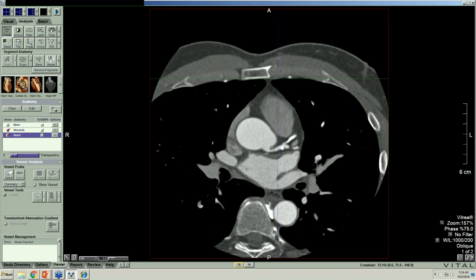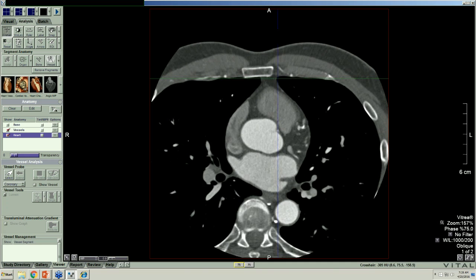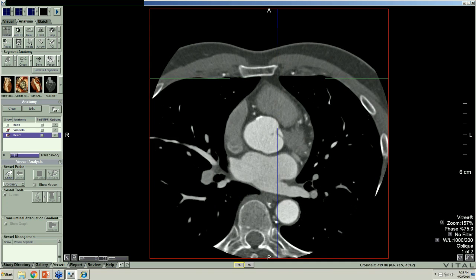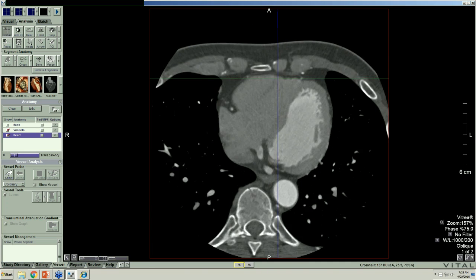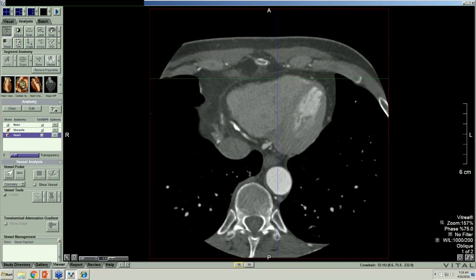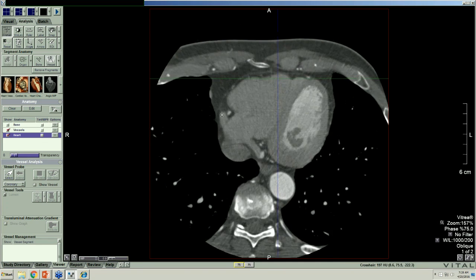It may have been some recurrent ruptures, but not an occlusion. And then fibrous changes, and then after that, calcific changes with remodeling the vessel and pushing out of the vessel to keep the channel open. You can see all that in the right coronary artery, even almost out to the bifurcation here.